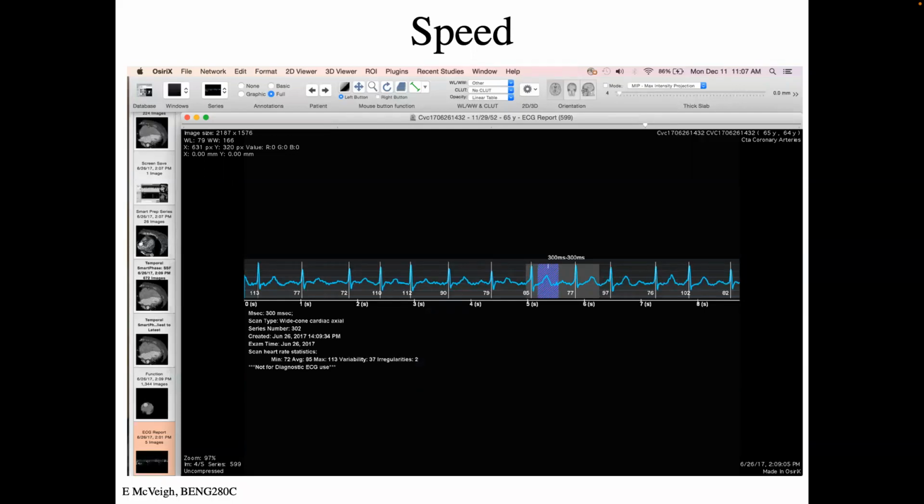Okay, their heart rate is not steady. The number here gives the heart rate that you would observe if this was the R to R interval. Okay, so it's 112 beats per minute if that's the R to R interval. Then that interval gets longer, so that's 90 beats per minute, 79 beats per minute, etc. So this is going all over the place. Not a good situation if you want to combine heartbeats into one image.